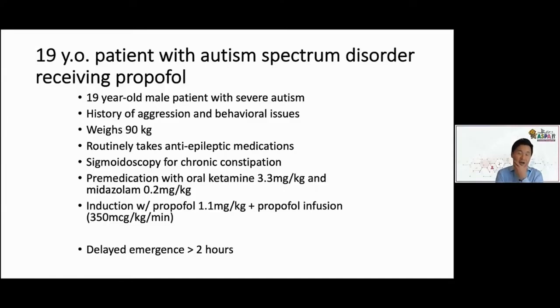So here again, my team was in the operating room recording EEG, but not able to intervene. This was for research purposes only. And plus, the people doing the recording were med students, so it's not like they would have had any sway over what happened. And it all happened really fast too.